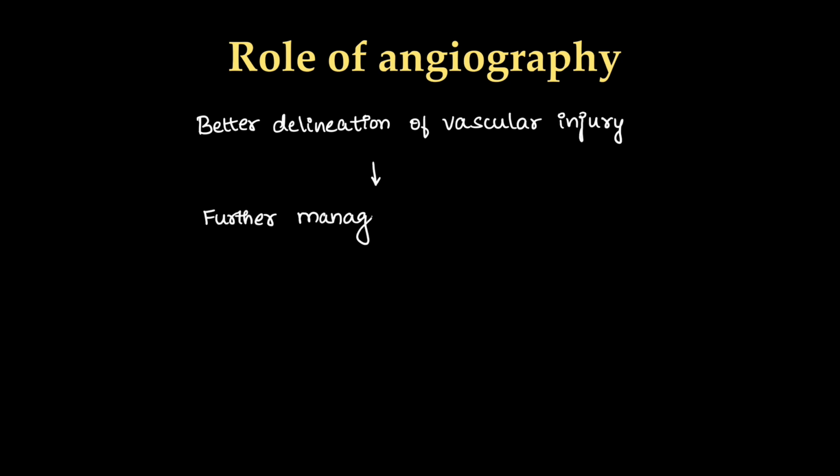What is the role of angiography in renal trauma? There will be better delineation of vascular injury which can concurrently be managed on the same table by angioembolization. So this is both diagnostic and therapeutic at the same time.